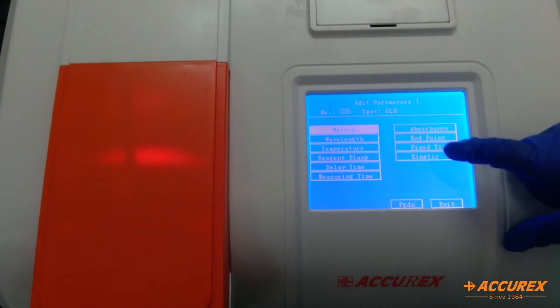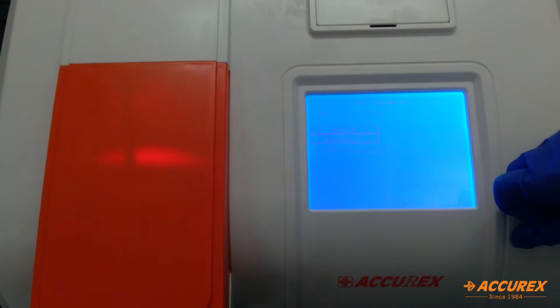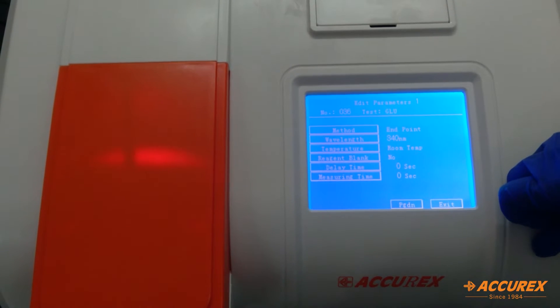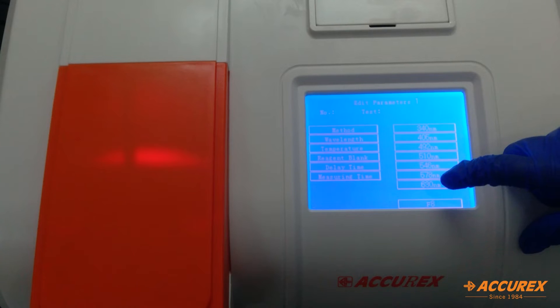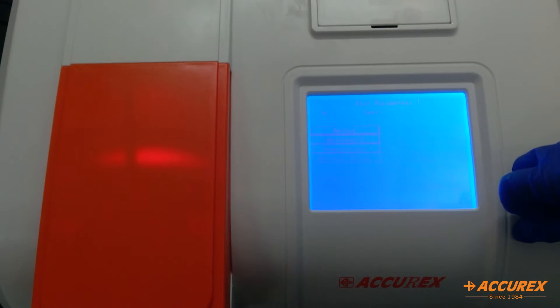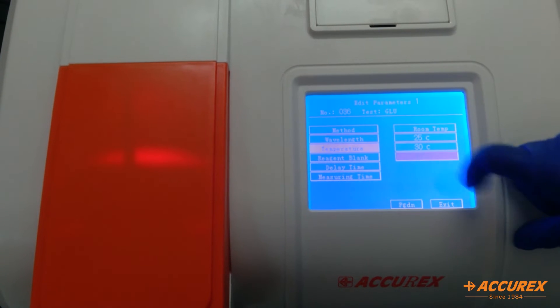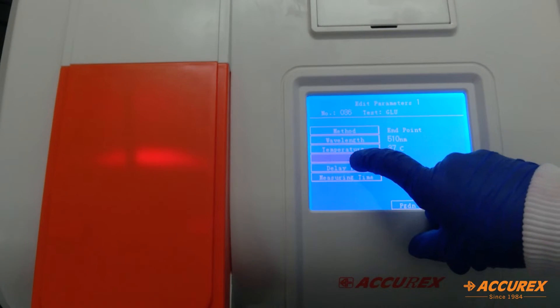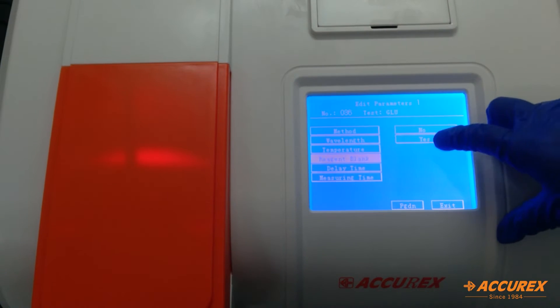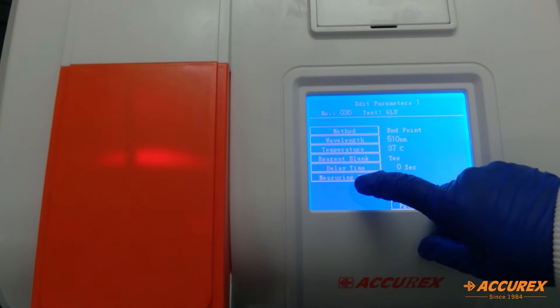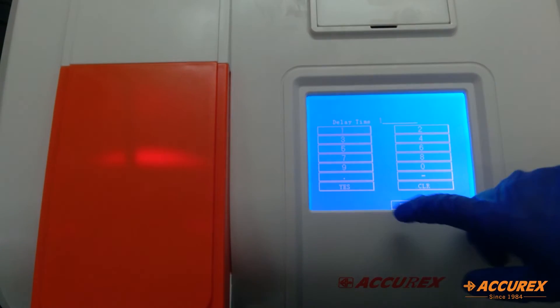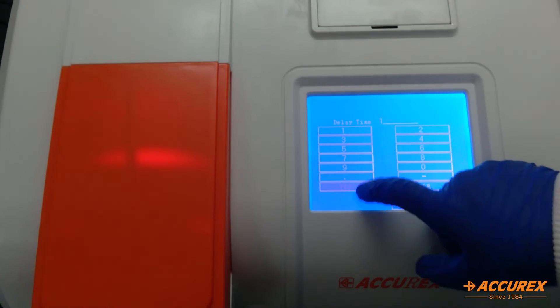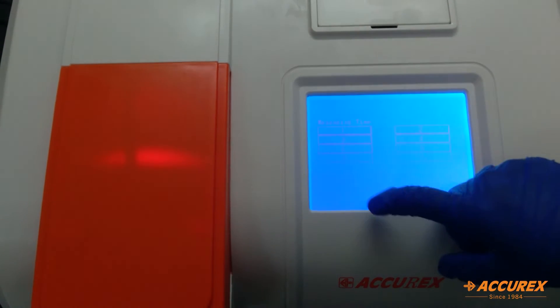For the method, we'll select endpoint as glucose is endpoint. Wavelength will be, we have to select from all of these filters. Select 510. Temperature will be 37 degrees. Reagent blank, yes. Delay time will keep 1. Measuring time will keep 1.